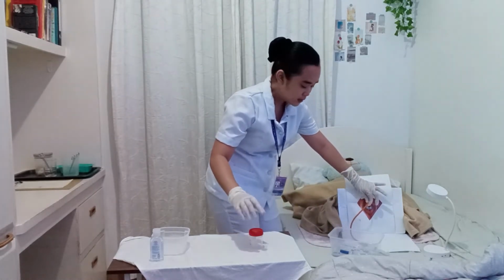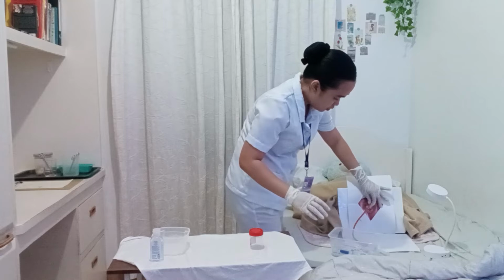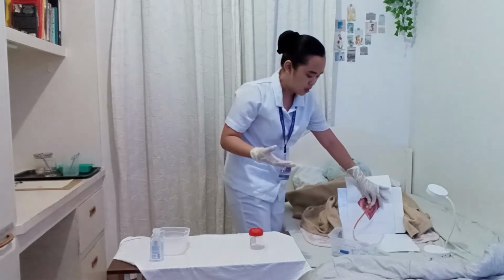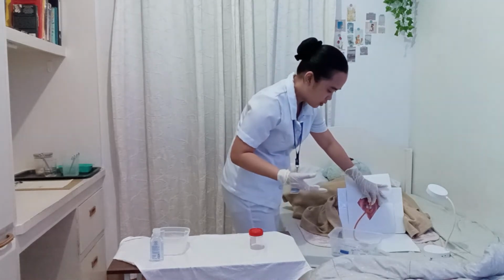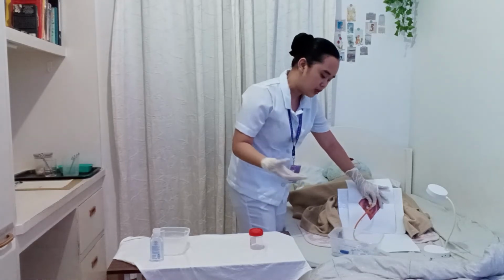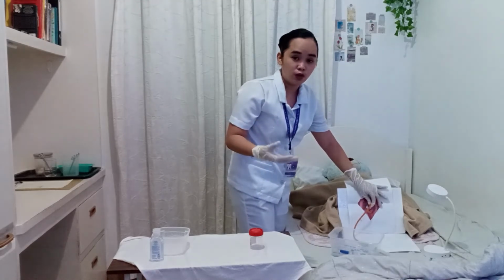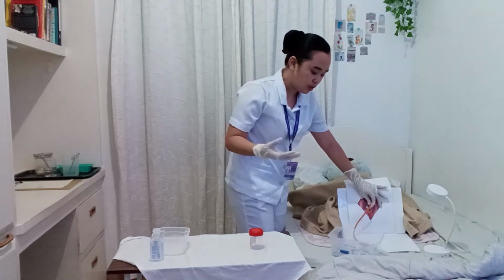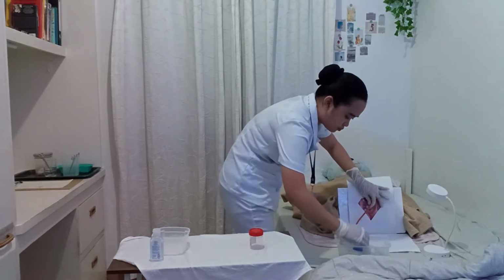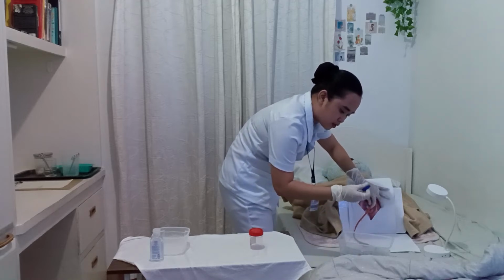Okay. And then rest your hand on the patient's pubis, okay, while holding the catheter in place to avoid pulling and pushing of the catheter, which may cause contamination of the urethra. Okay? So now we're going to connect the urine bag to the catheter while making sure that the urine bag is closed to avoid leakage. And of course, this will maintain the sterility of the connection. Okay? I'm going to open the cap.